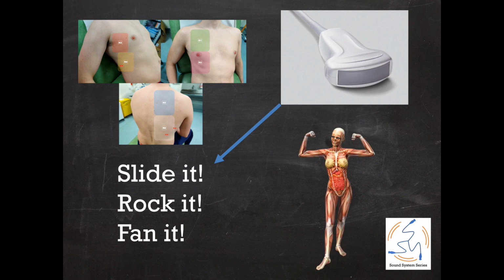And finally, remember your anatomy and try to conceptualize anatomy before you look at the sonographic image. This can really simplify your ability to get an image. Remembering these key tricks can help you own the lung exam and make you feel confident next time you evaluate your patient.